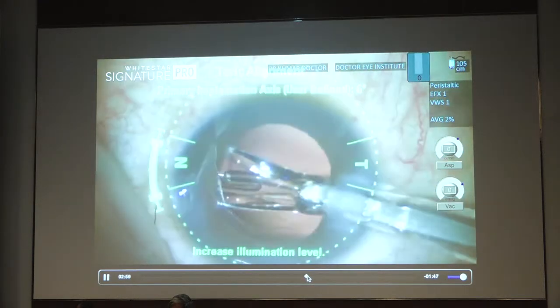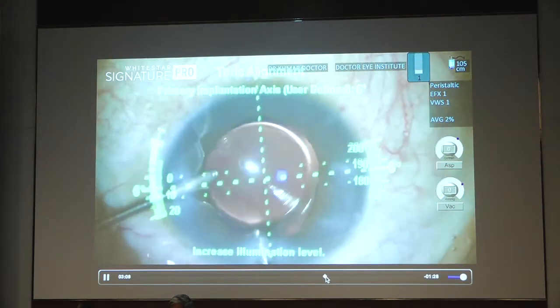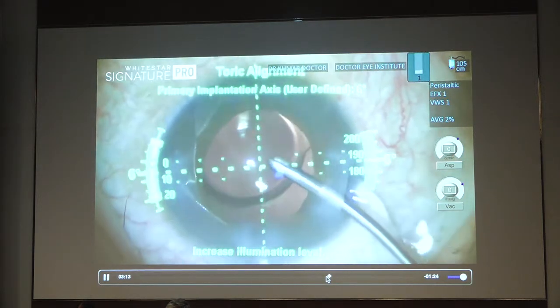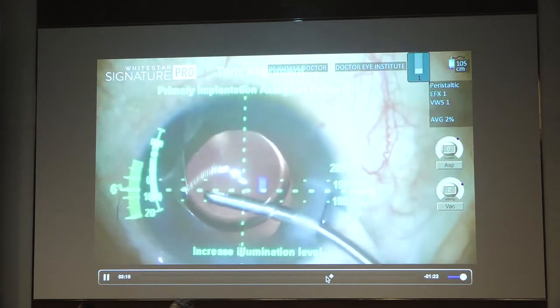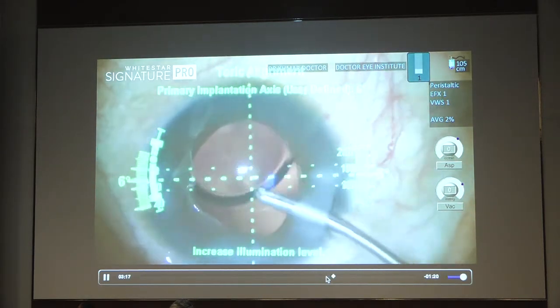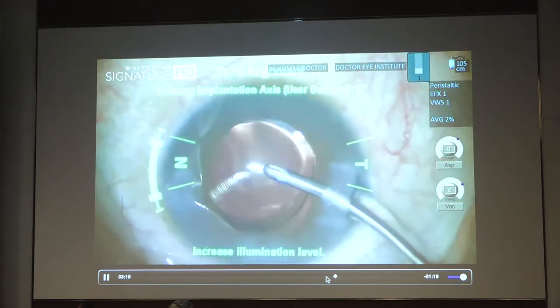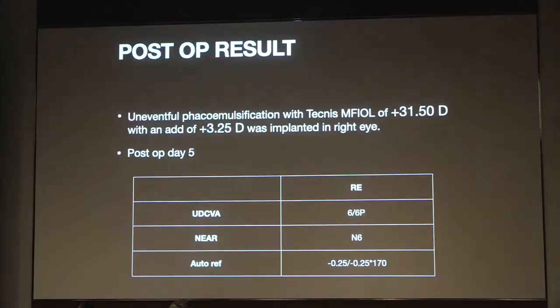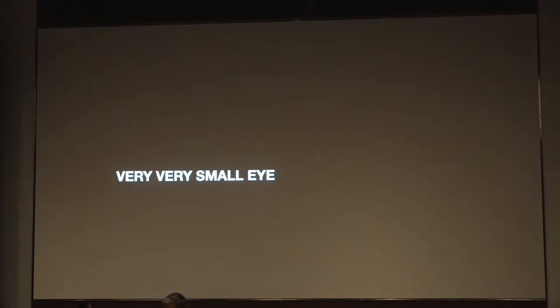Once this goes in, just make sure that it's placed horizontally. We got Verion technology, so we are aligning the toricity of the lens, which is at 6 diopters, then removing the viscoelastic from the front and back. Here, a very, very shallow anterior chamber, you have very little space of 1.92. So a Technis multifocal, a 31.5 with an add of 3.25, and we got excellent results. So this was a short eye, very small anterior chamber, but we got very good results.